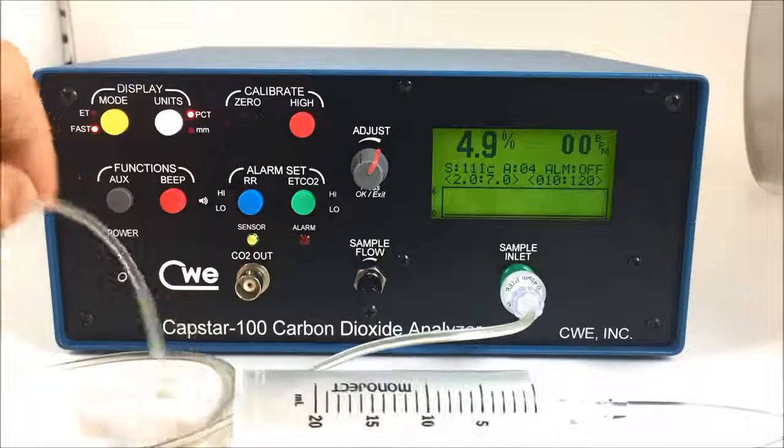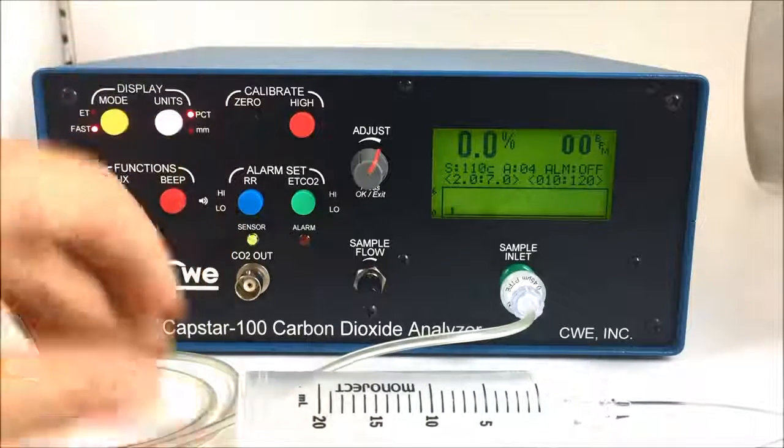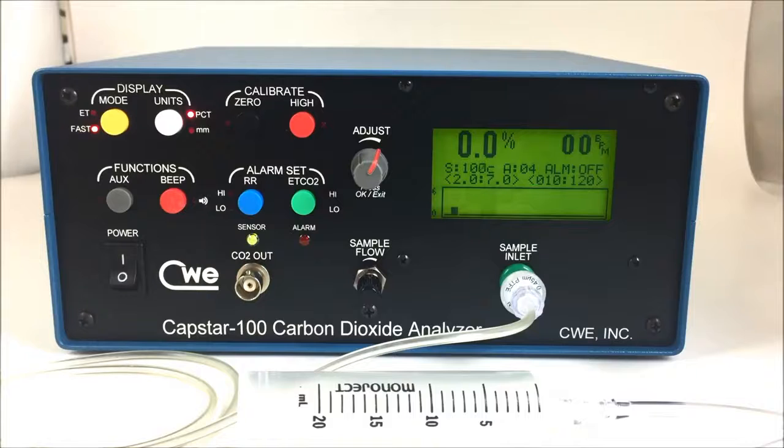That completes the calibration routine for the Capstar 100 by CWE Incorporated.